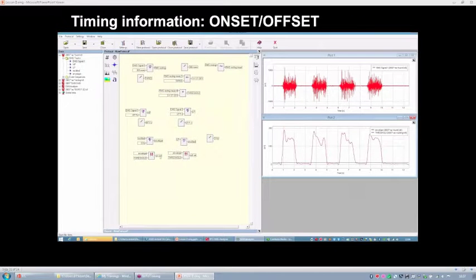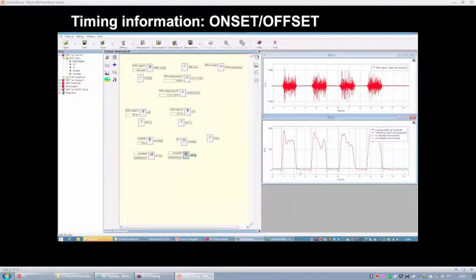So this is also a very quick and easy example that you can use to compute the onset and the offset value. In this case, for example, if we have a cycle, we can define a cycle, and we can say what the duration of the activation period of the muscle is with respect to the entire duration of the cycle, for example. And you should already know how to do it if you remember what we did during the previous lesson.